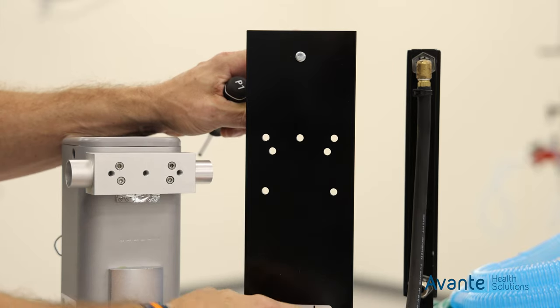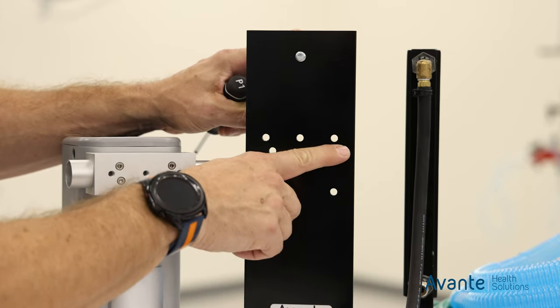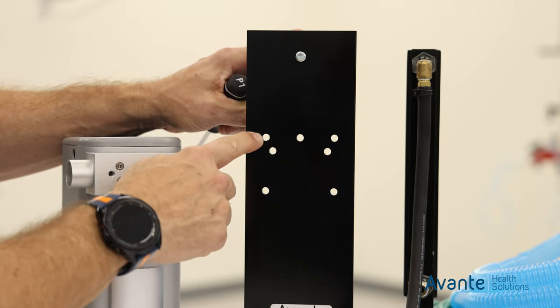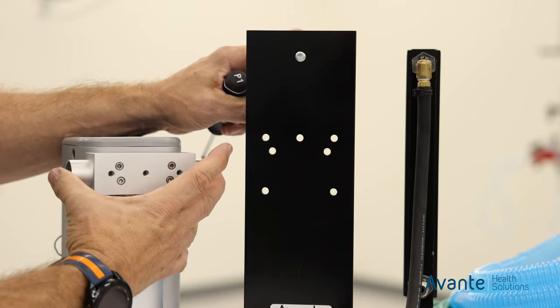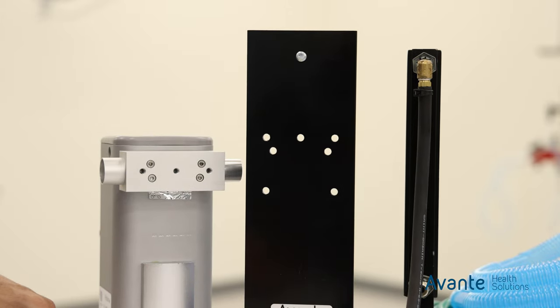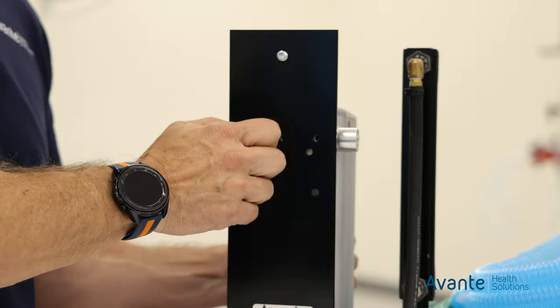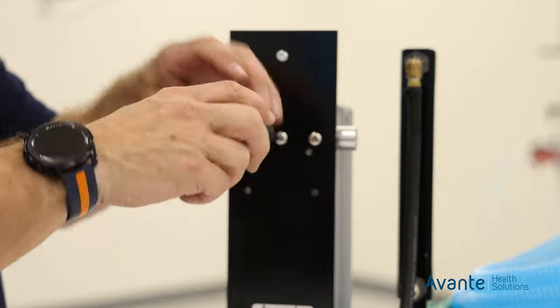Now we're going to go over how to attach the vaporizer to our upright bracket. The upright bracket will have a variety of bolt patterns, but the ones we're going to be interested in are the top three, which will match up with the top three holes in our cage mount. Using 6 millimeter by 16 screws, pick up the vaporizer, line it up with our holes, get all three secure, and then we can move on to the next step.